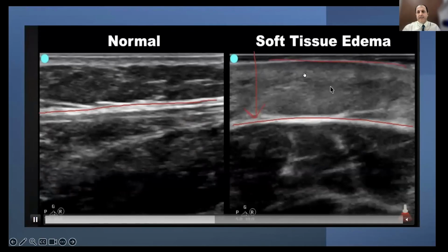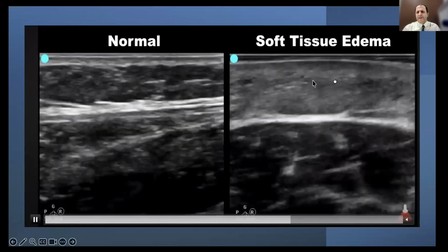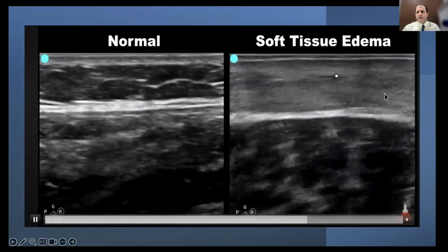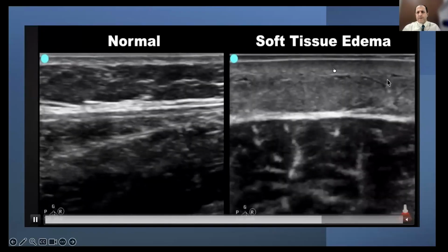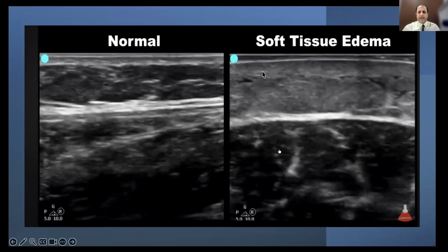It's clearly, we can see that there is a skin thickening, and so it is early stage of cellulitis. At the same time, you can find some fluid accumulation in subcutaneous layer, so it's early stage of cobblestoning stage. It is a typical case of cellulitis.